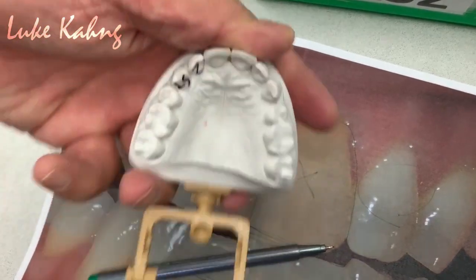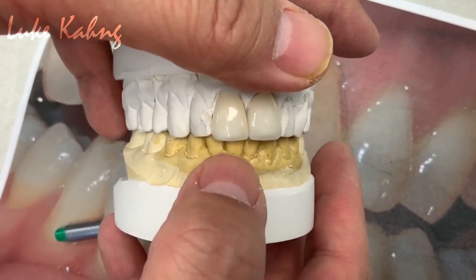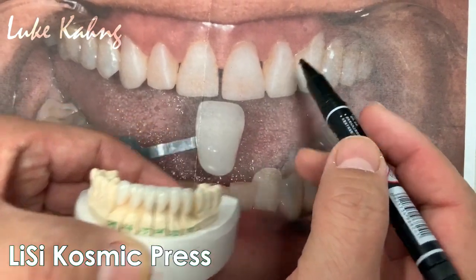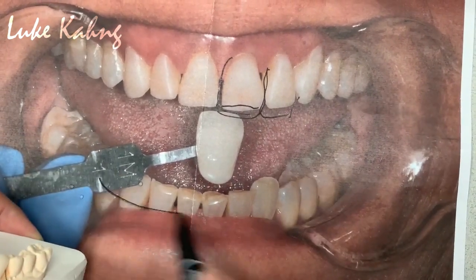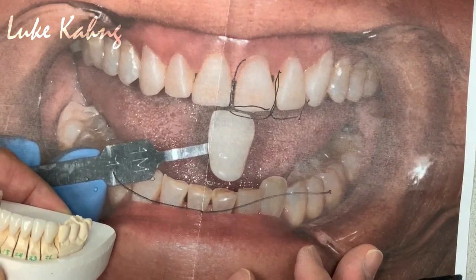That one is good. So make the long neck, possible flat neck. It's a nice one. Now continuing from the upper, as a diastema. Nice, now is lower, all the lowers make the better aesthetic and contours.